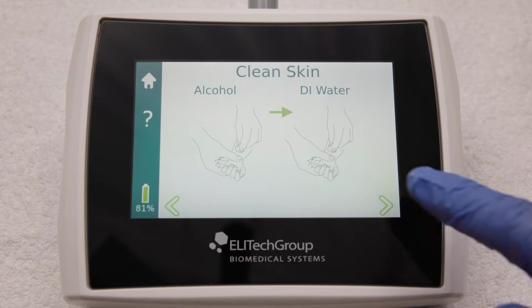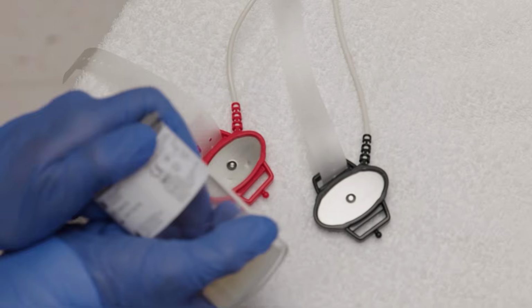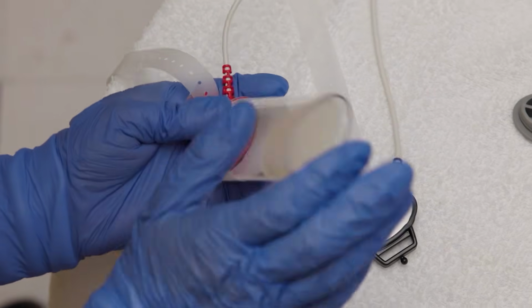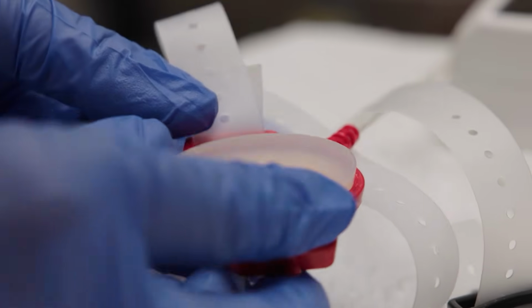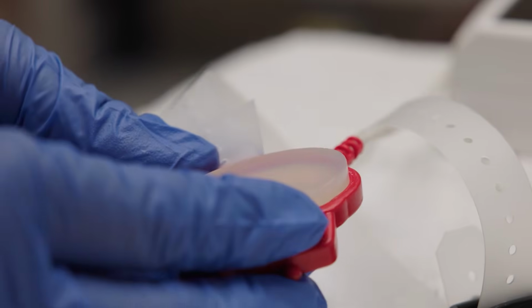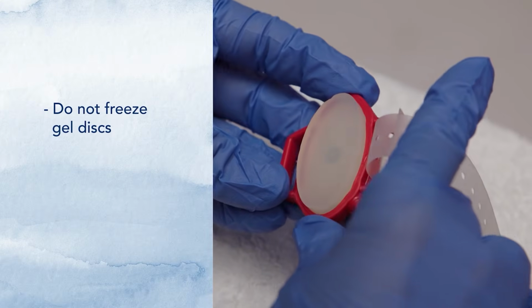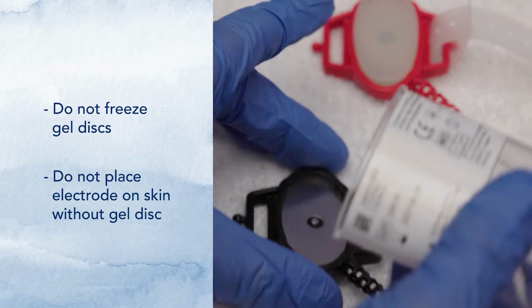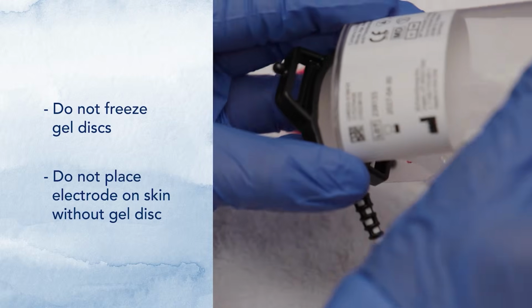Next, advance the screen and add a gel disc to each electrode. It's normal for the gel disc to bulge slightly. Be sure to inspect the gel discs for any cracks or bubbling and discard if present. Gel discs should never be frozen. Never place the electrode on the skin without a gel disc in place, as this can cause burns.